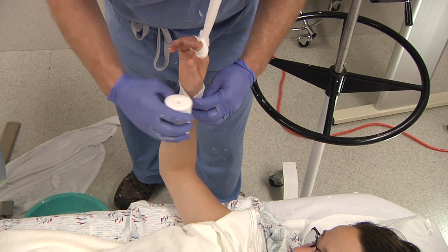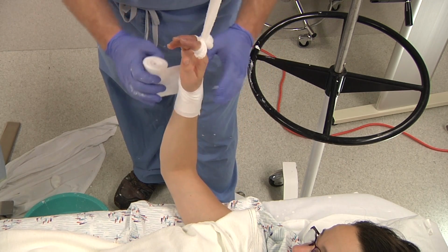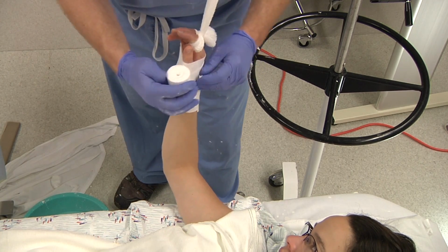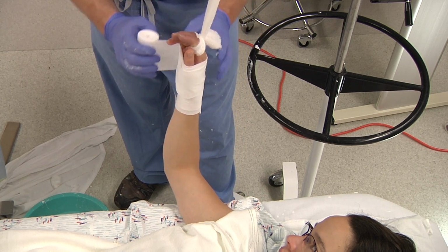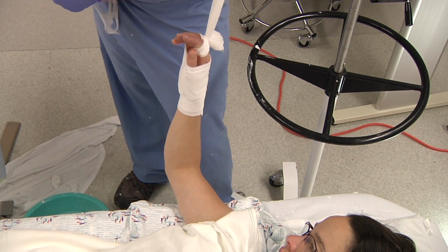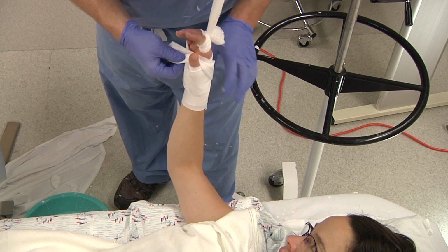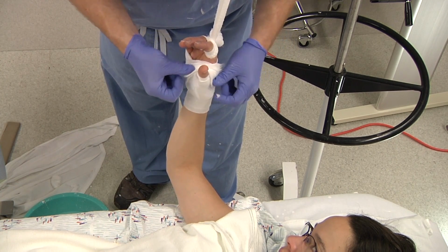Then we wrap with our cotton web roll. Always a minimum of 4 layers at the top and at the bottom. It's very easy to extend it past where your plaster is going to be going, because it's very easy to tear the web roll. Make sure to pad between the thumb. This can be done a number of ways.